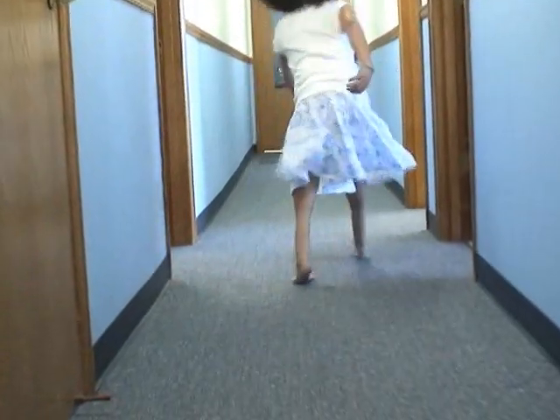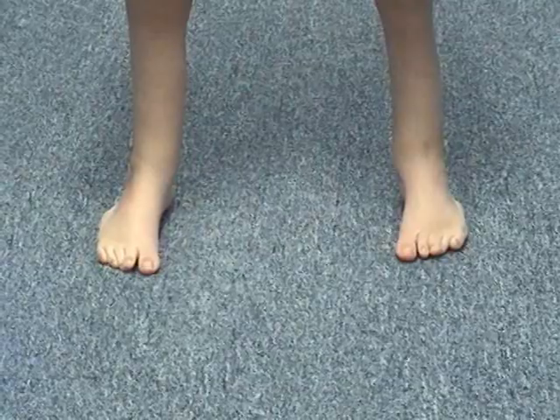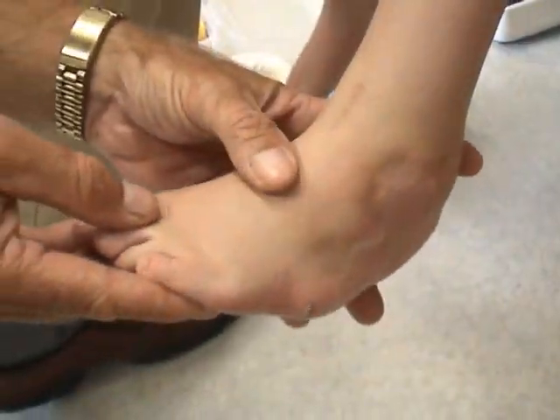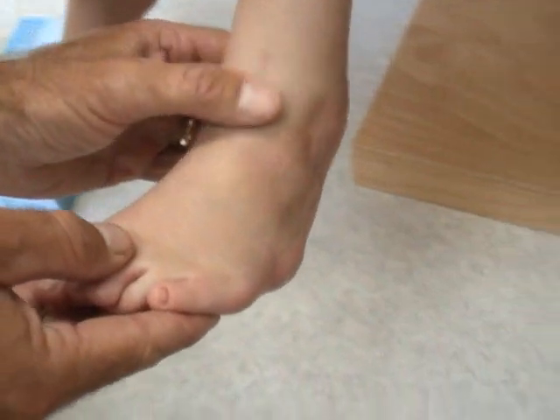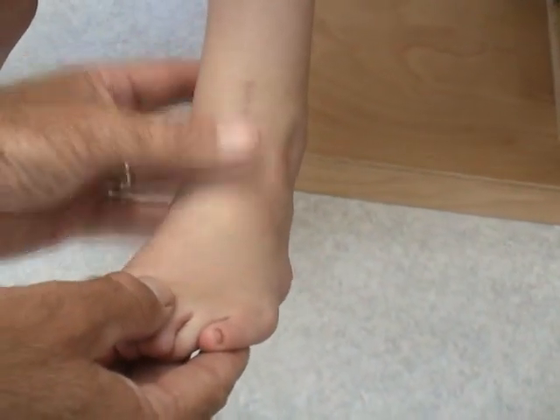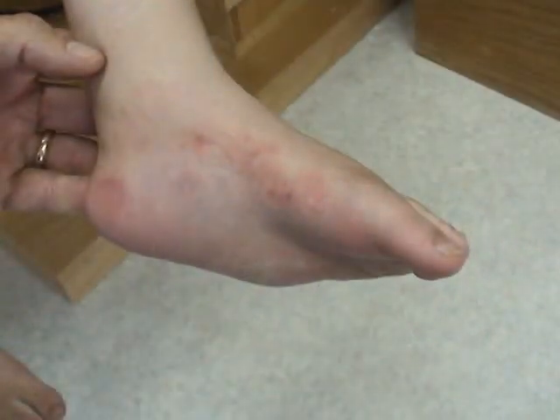Her heel doesn't make significant contact with the ground when she is barefoot, and in fact it is the inconsistency of foot contact to ground that makes her appreciate the extra stability of the braces. On the close-ups you get a better understanding of the rather unique appearance of her foot: the strong forefoot adduction, the prominence of the base of the fifth, and a general sense of the height of the medial arch.